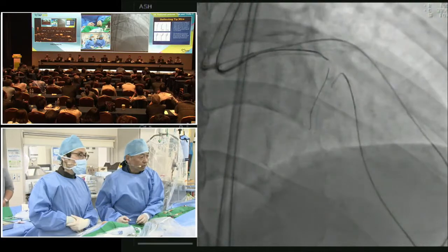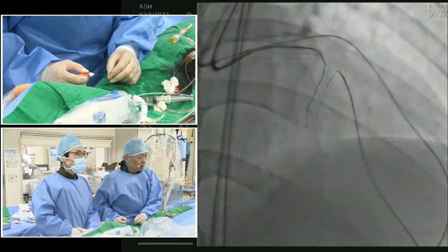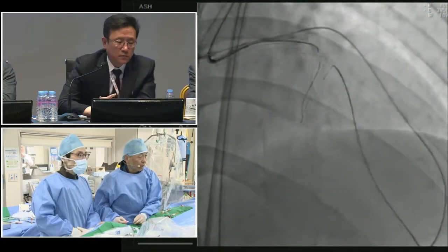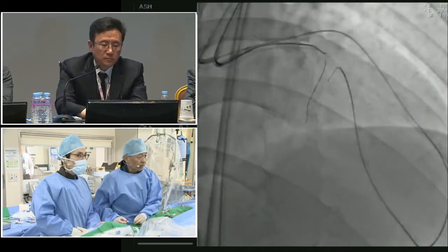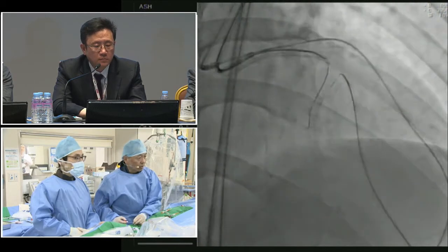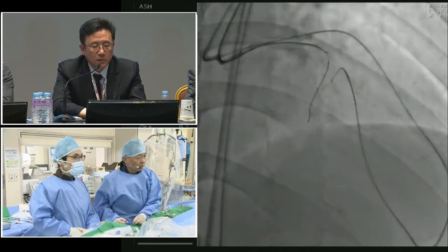So probably I think calcium is disturbing. Can you show us the IVUS image? No, IVUS is not showing now, it's going out. IVUS is outside of the vessel. Of course, under the direct observation of IVUS, finding is better. However, this plaque is very narrow, so guide wire control looks very difficult. So I put back the IVUS system, and after penetration, I want to confirm later.